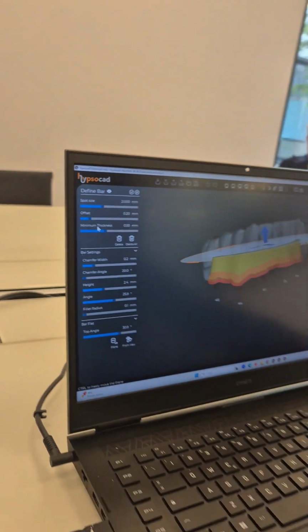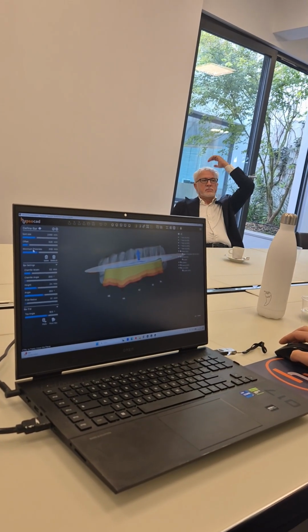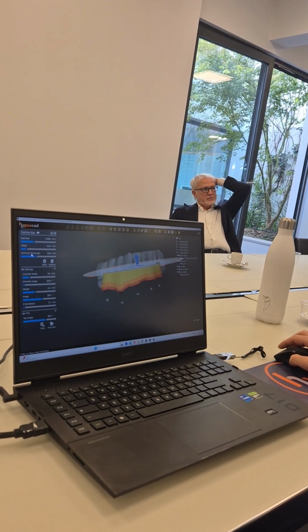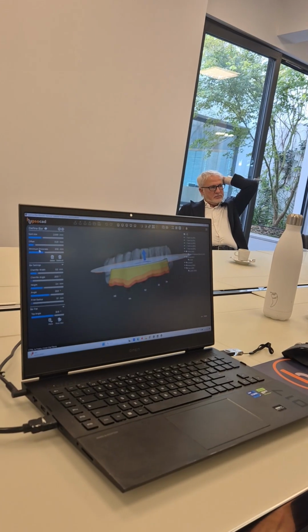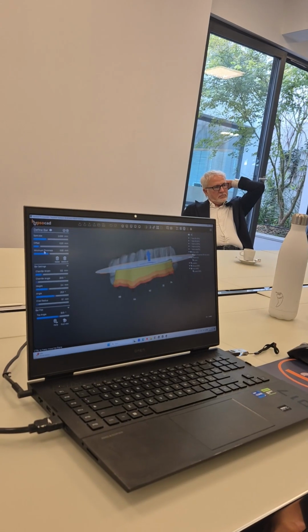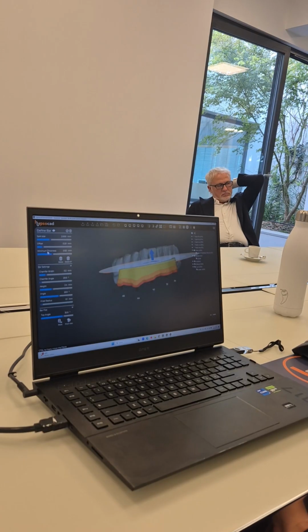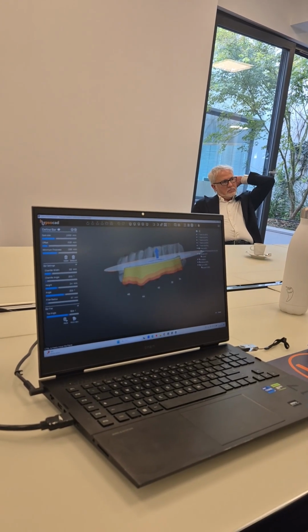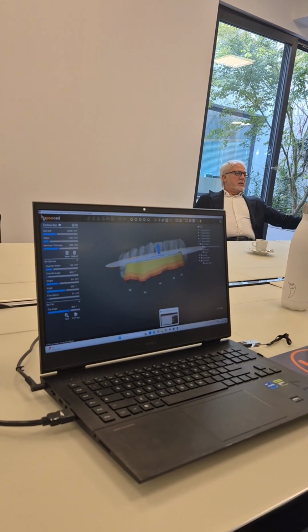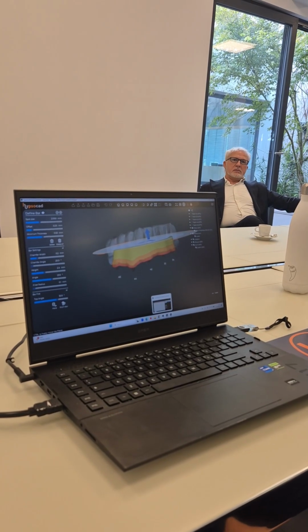Okay, but does this offset mean that the bar with the upper part is from an ideal situation like 0 to 0, or can we have a preset? Because if the bar is from laser melting and the upper part is milled, we have to do extra compensation. Usually dental technicians like to scan the bar and then make the upper part, due to fitting problems. Do you have any special tricks to avoid that? It's automatic.